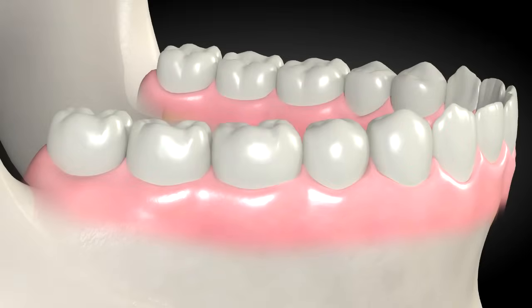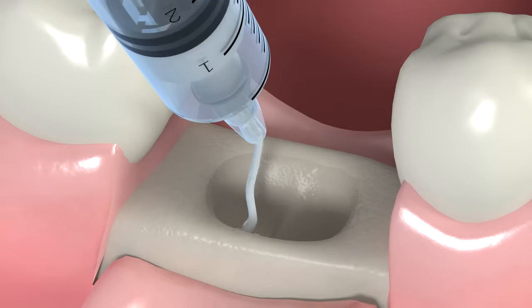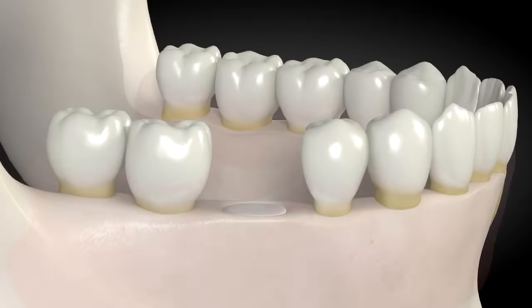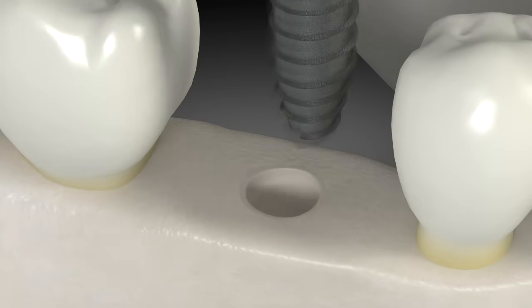Socket grafting is bone added at the time of your tooth removal. The tooth will be removed and the bone grafting material will be placed in the hole left after removing the tooth, for a four-month healing process. The bone heals and the dental implant can then be placed.